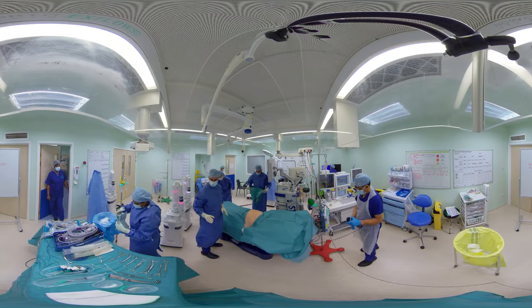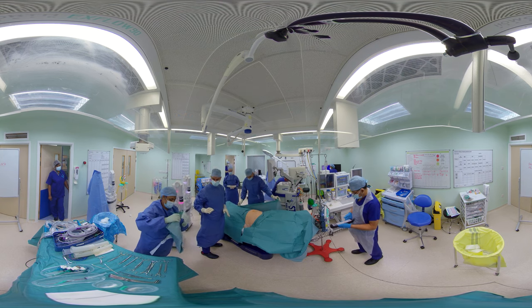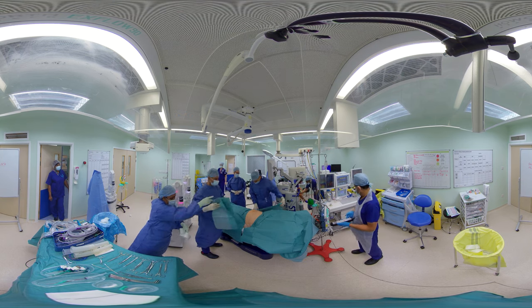The patient's abdomen has been prepped with chlorhexidine solution, and we are now applying the drapes.